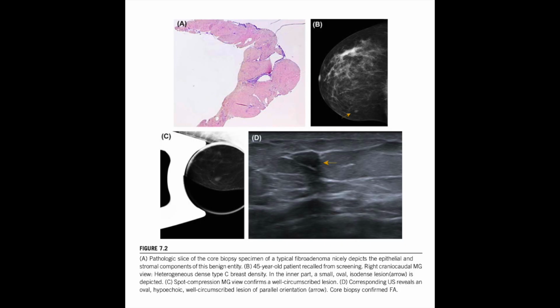So when a radiologist gives a mass a BI-RADS 3 category, that means probably benign, the chance of it being cancer is incredibly low. What are we talking? We're talking greater than 0, but less than or equal to 2%. And to get that label, a mass needs two key features. First, its shape has to be either round or oval. Okay, simple enough. And second, and this is crucial, it must have circumscribed margins. So, smooth edges, a shape you could trace pretty easily. If it looks organized, it probably is. That's a great way to put it.